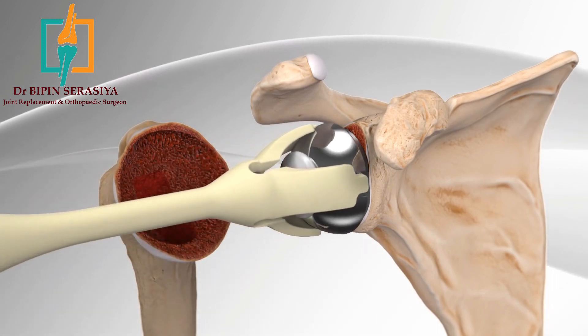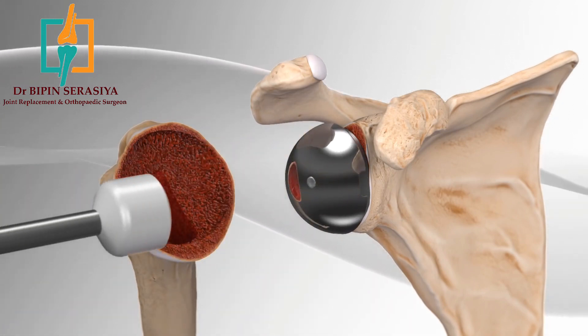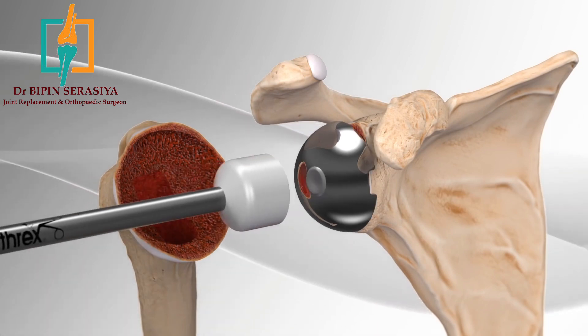Finally, the real replacement will be implanted with a ball on the metal plate and a socket that is attached to a stem that is placed into the humerus. This completes the reverse total shoulder replacement.